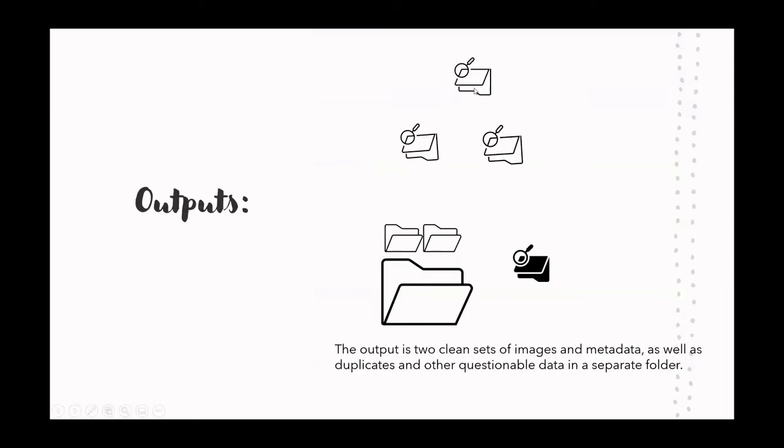So you would want to look through those JPEGs or DICOMs to get just the images and just the metadata and understand if there are any sort of dirty points in the data you need to get rid of. For example, what if you have 1,000 DICOMs, but it turns out 50 of them are duplicates?